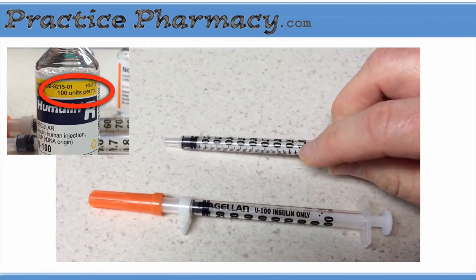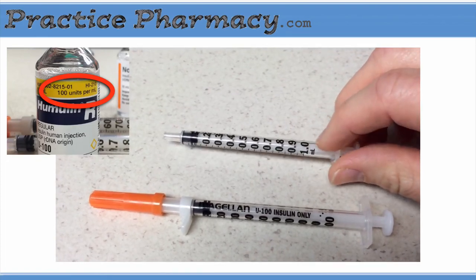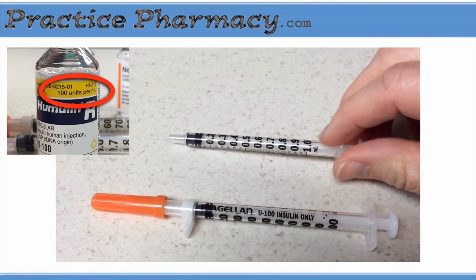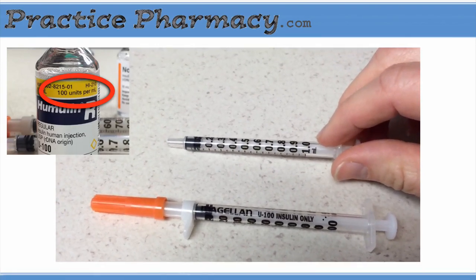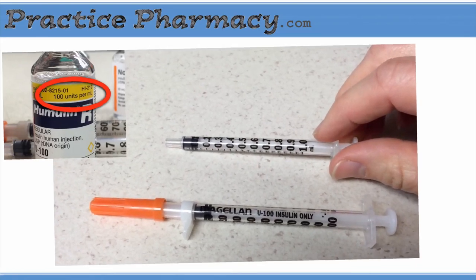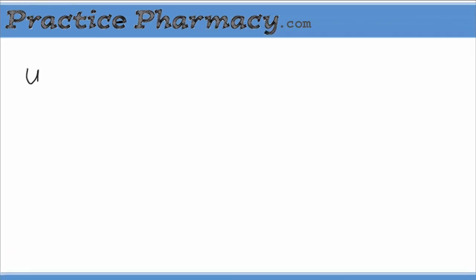This is an insulin syringe. When using an insulin syringe, you simply draw back to the line corresponding to the number of units of insulin that you want.